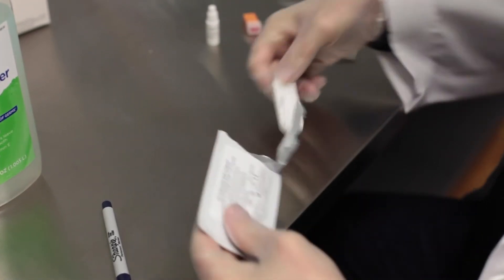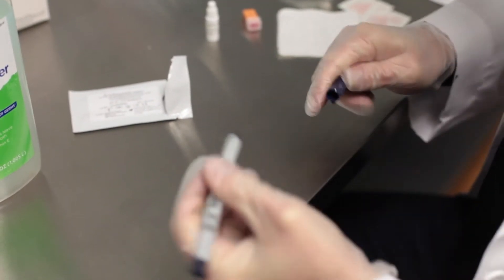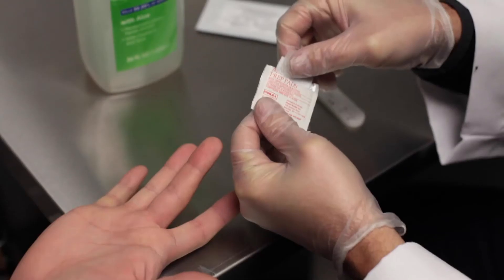Begin by opening up your test kit and writing the patient's ID on the test cassette. Twist the tab off the buffer vial without squeezing, then carefully pull off the sterile lancet cap.